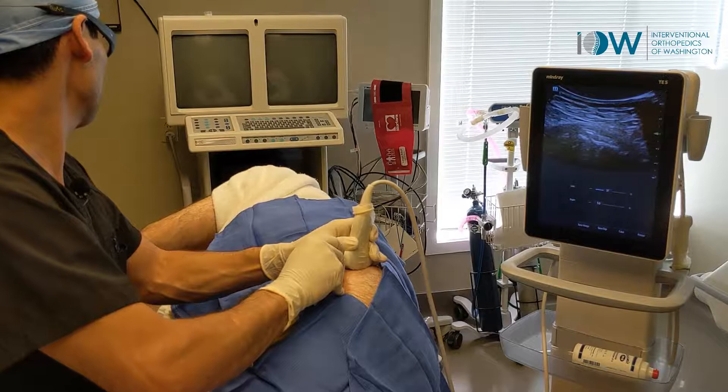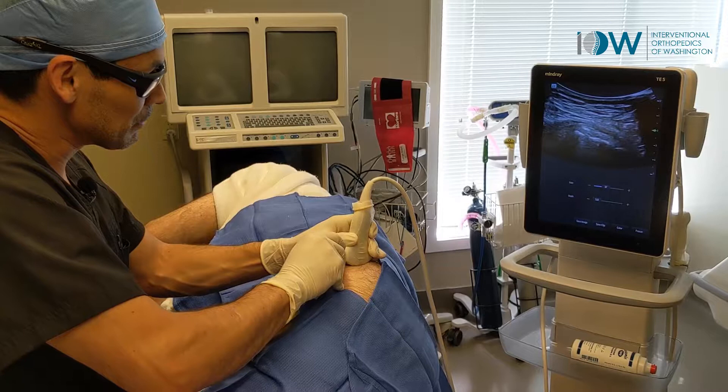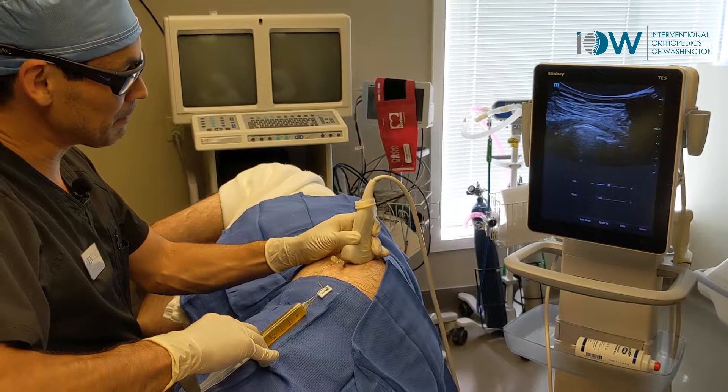You feeling okay with that? Absolutely. So back and forth, some fenestrations, inject some platelet-poor plasma, filling up the area a bit.